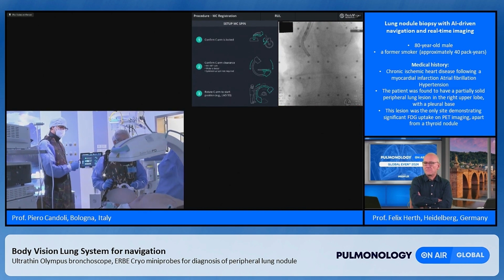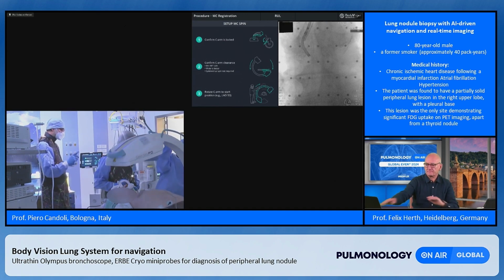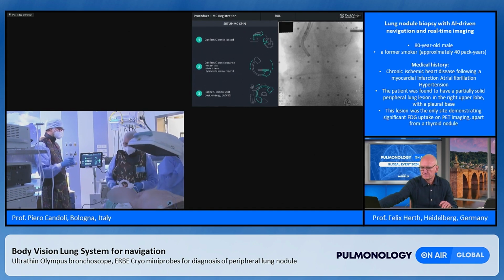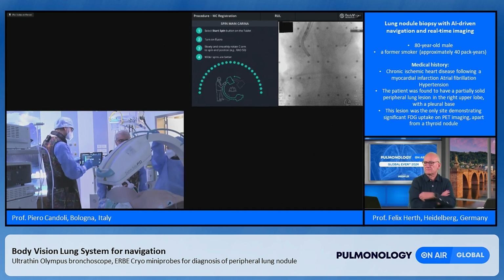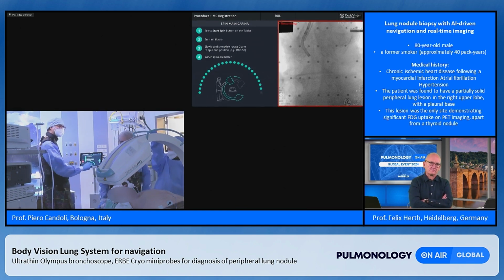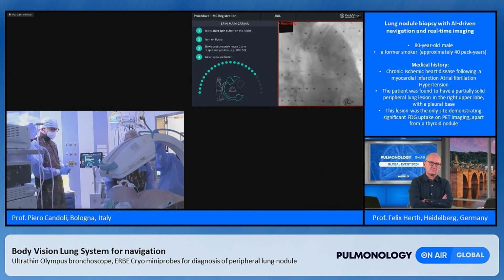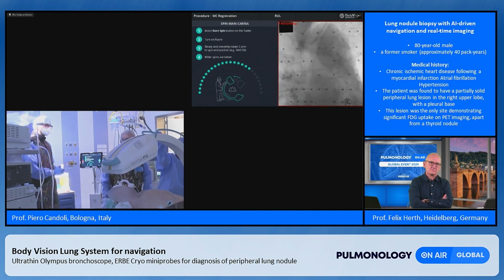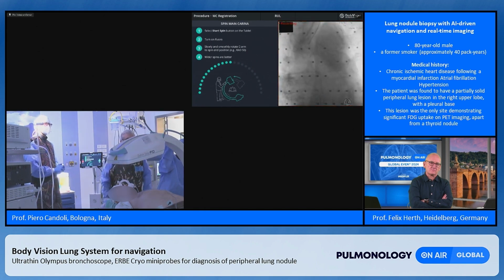So, when the operator is ready, we perform a first spin from right to left, 30 degrees right and 30 degrees left. Now we are ready? Okay. We start the spin. We have to perform it slowly and smoothly.